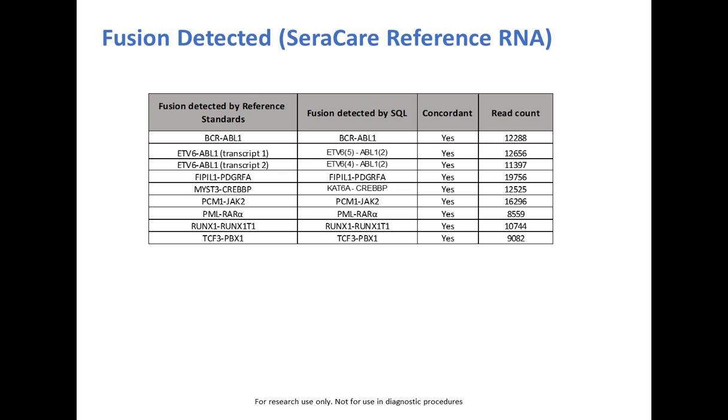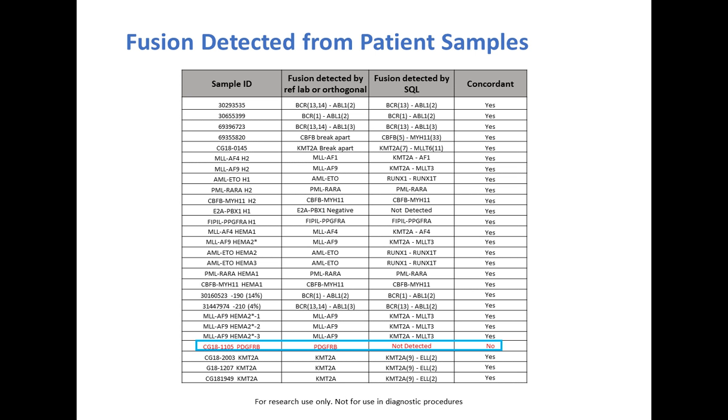The fusions detected from Seracare reference RNA, we identified all 9 transcripts from the sample. The read count is above 10,000 for most of these. Next is the data from the fusion we tested for patient sample.